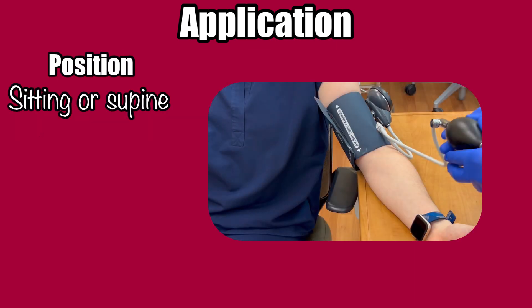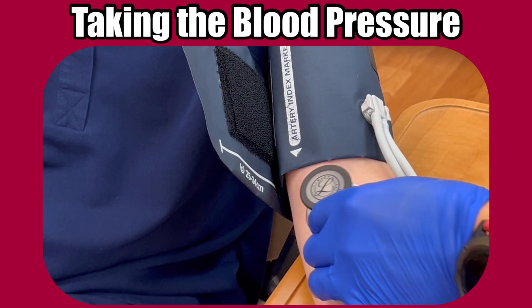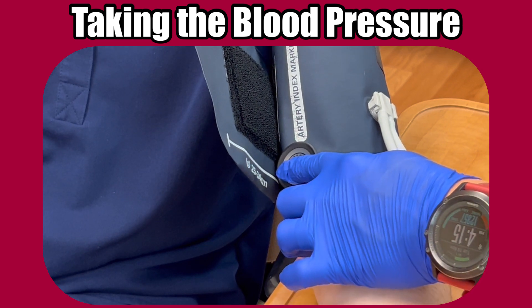Blood pressures can be taken with the patient in a sitting or supine position. Have the patient relax their arm at about the level of the heart — resting on the bed, arm rest, or bedside table can work. Now set yourself up to use the stethoscope. Place the diaphragm over the brachial artery site. You won't hear a pulse yet, and that's normal. We'll start hearing things as we inflate and deflate the cuff.